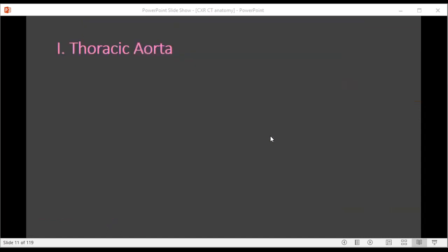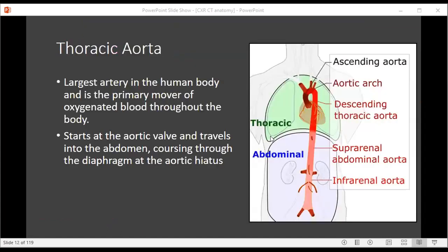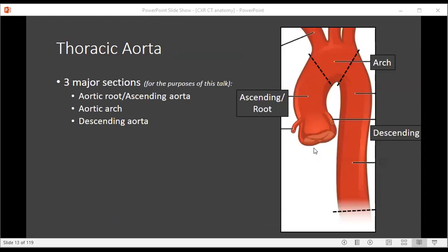Let's first start talking about the thoracic aorta. The thoracic aorta is the largest artery in the human body and is the primary mover of oxygenated blood throughout the body. It starts at the level of the aortic valve, which is in the mid chest, and then ends within the diaphragmatic hiatus where it passes into the abdomen. There are three major sections of the aorta: the aortic root, aortic arch, and descending aorta. The aortic root and ascending aorta will be combined for the purposes of this talk.